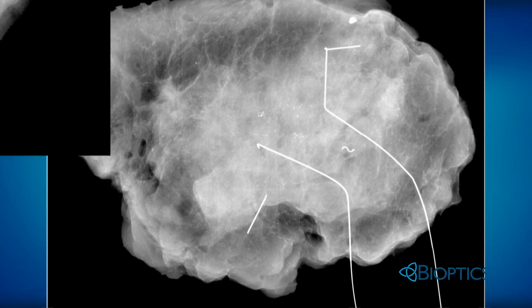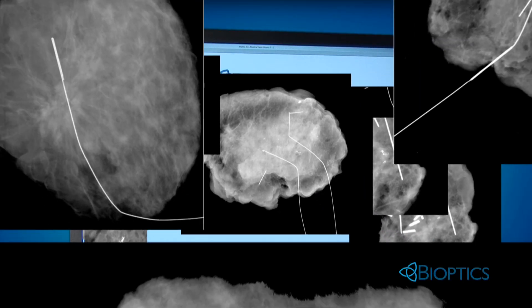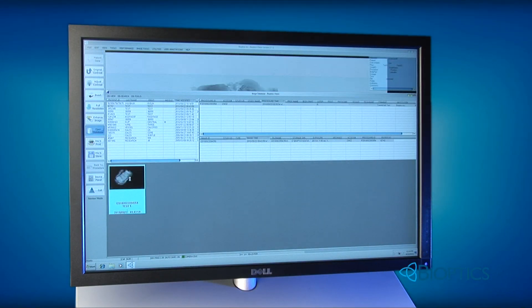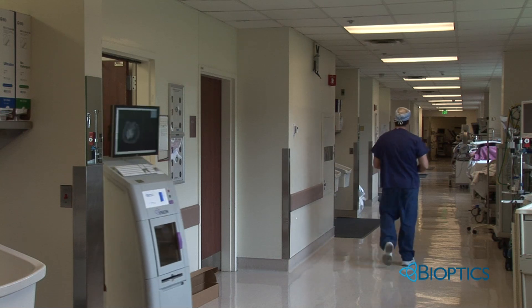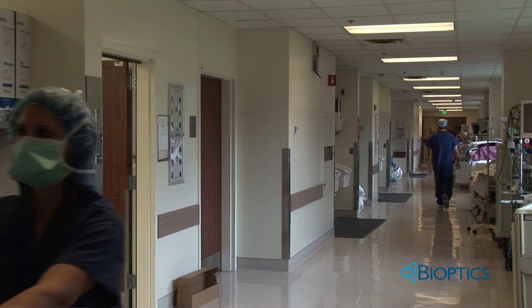Bioptics BioVision can archive over 40,000 images internally, offering a convenient backup storage, while all images can be uploaded to the PACS for shared review and archiving. The BioVision is easily moved from room to room because the internal battery eliminates the need to shut down and restart the unit.